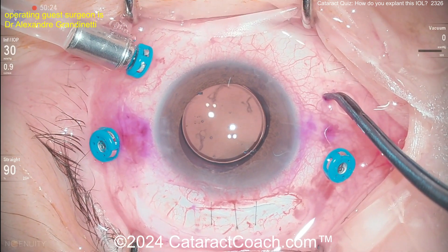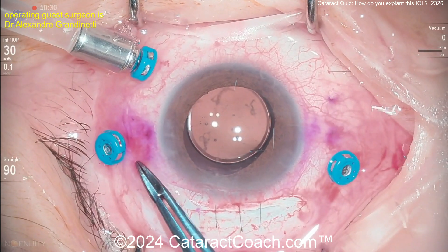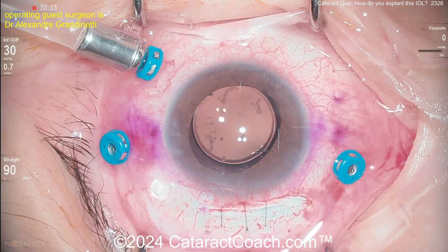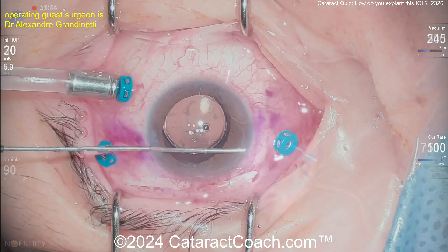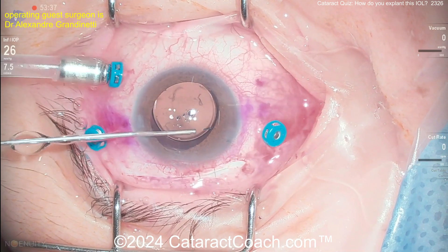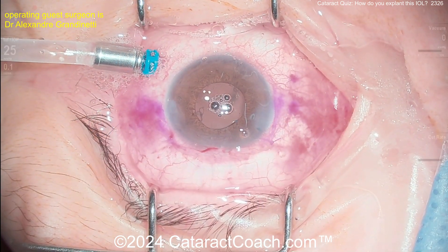Looking at the main incision closed with two or three 10-0 nylon sutures. The flanges for the haptics are being buried within the sclera, not just sitting under the conjunctiva, because that may erode through. Going back to the posterior view to finish up — a nicely cleaned-up posterior segment — and making sure there are no breaks in the peripheral retina. At the end of the case, bring the pupil down a little bit.